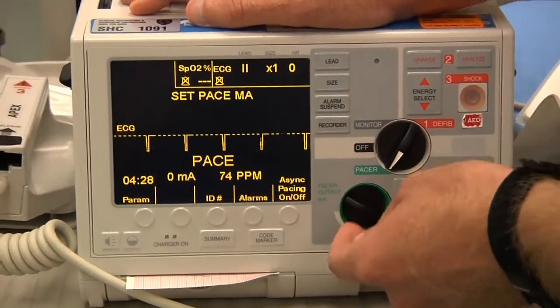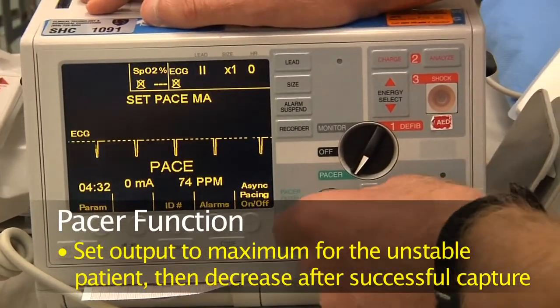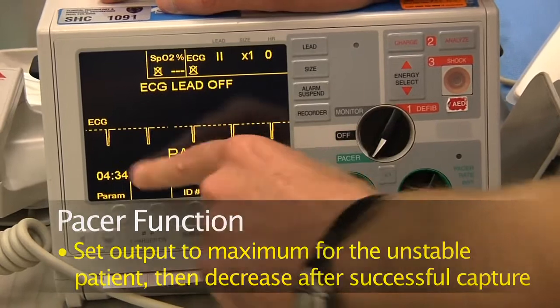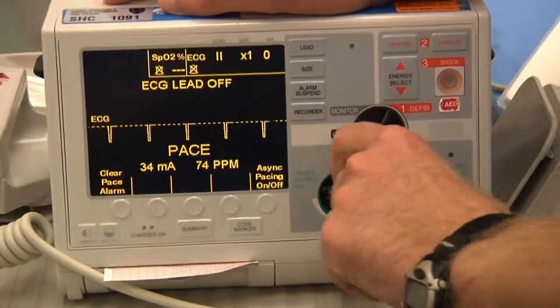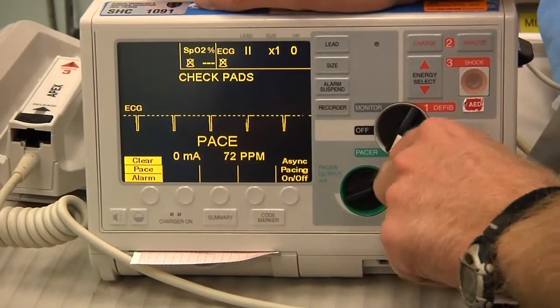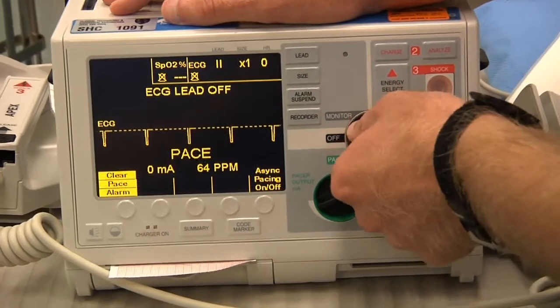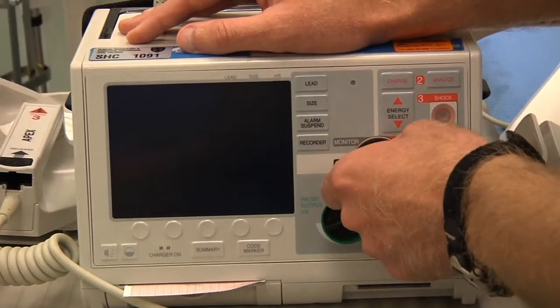In an unstable patient, you want to go all the way up to maximum output and then go back down. And you just increase here. You notice the amplitudes. It's unhappy because it's not connected to the patient, so it's alarming. So now I'm going back to 0. Now, one other thing to note about the pacer, just turn it off so it won't squawk at us.